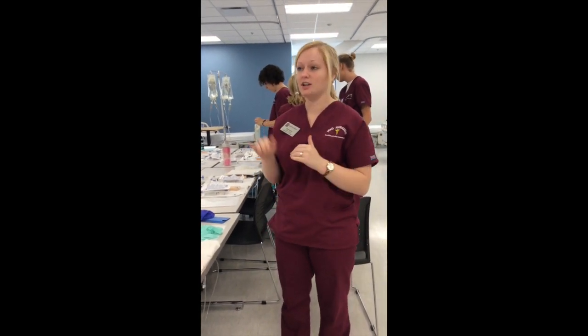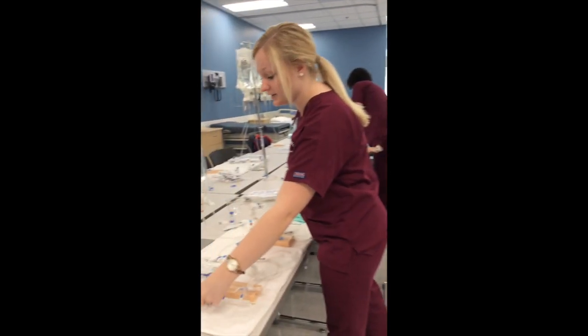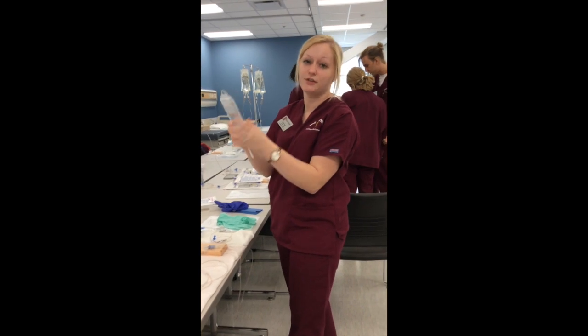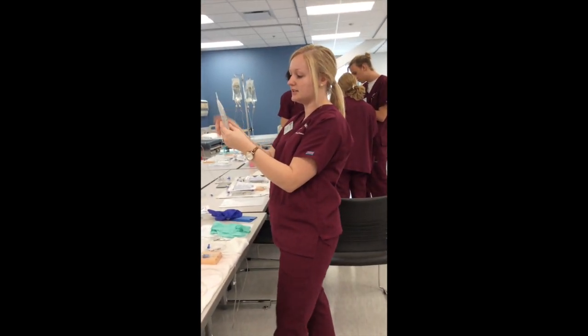Okay, I'm going to demonstrate how to give an IV piggyback. So the first thing I'm going to do is go to my MAR, and go and get my medication. So I'm going to look at my MAR for the first time. I'm going to check to make sure, yes, I'm going to be giving levofloxacin, 500 milligrams. I'm going to compare this with the doctor's order since this is the first time I'm giving it. So yes, levofloxacin, 500 milligrams, give over 60 minutes.